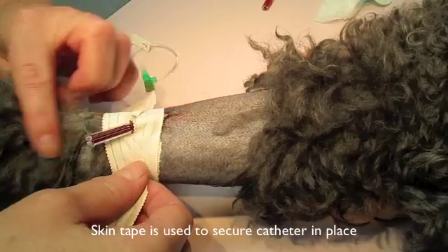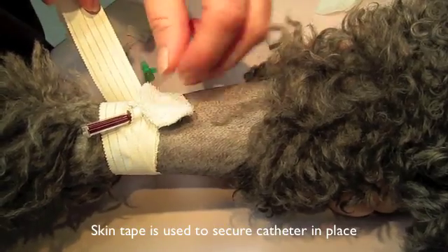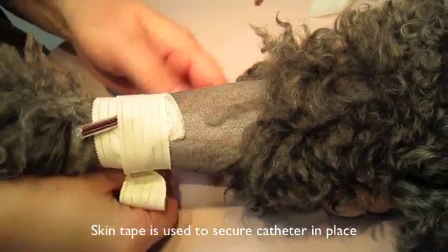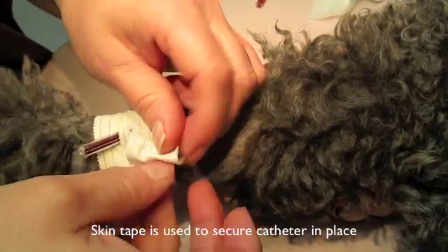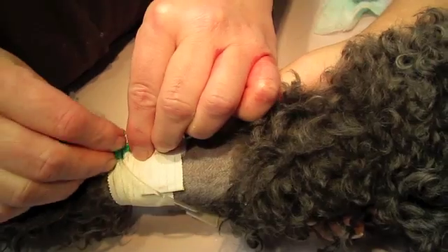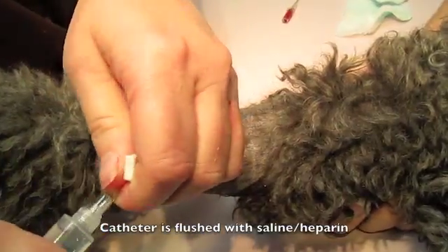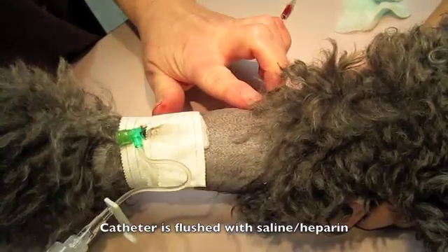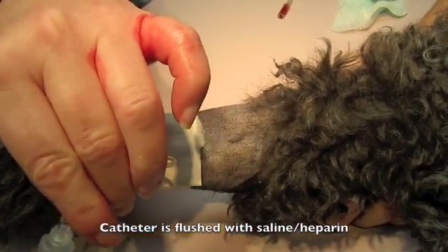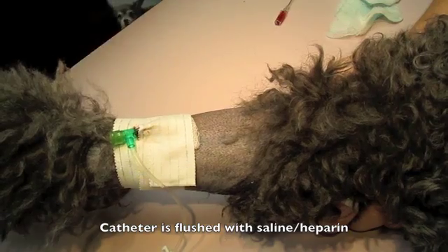More tape is placed here. That is a piece of gauze with an antimicrobial ointment placed right at the spot where the catheter enters the skin to prevent infections. This part is called a T-port, which allows us to give injections into the catheter. This is a serosaline and heparin flush to make sure that the catheter hasn't developed any clots in it and is ready for use.